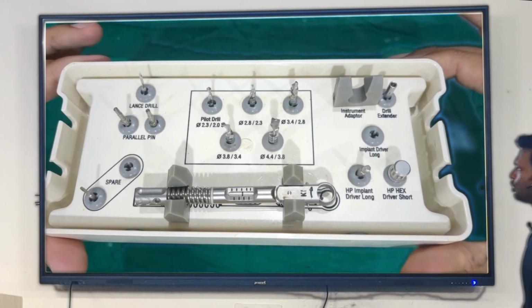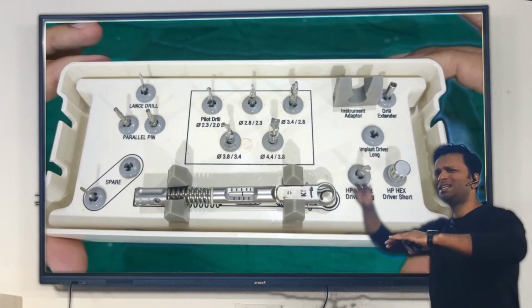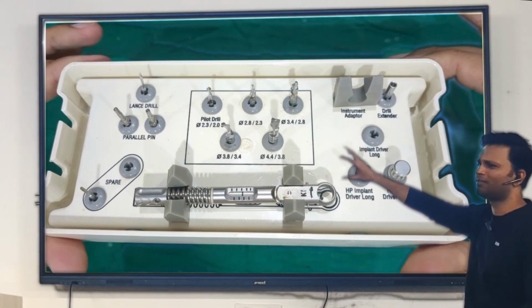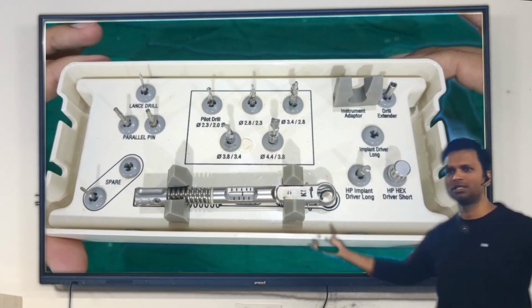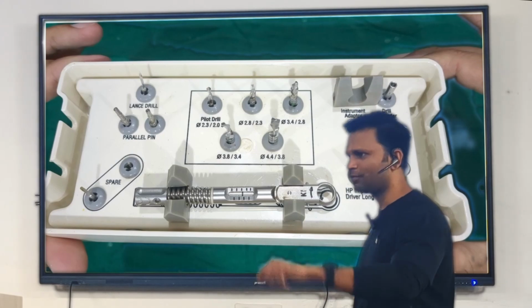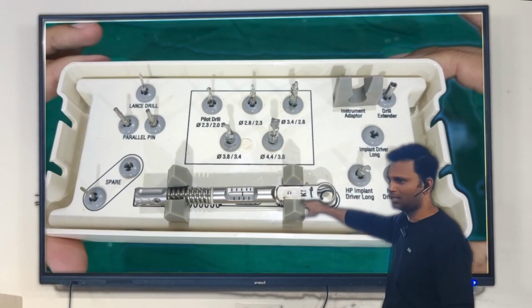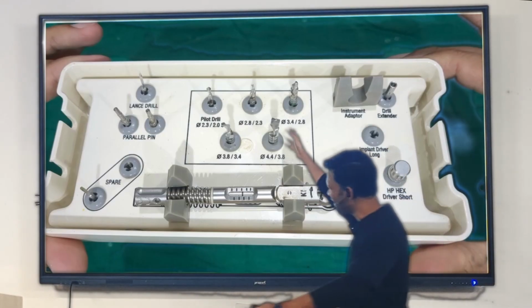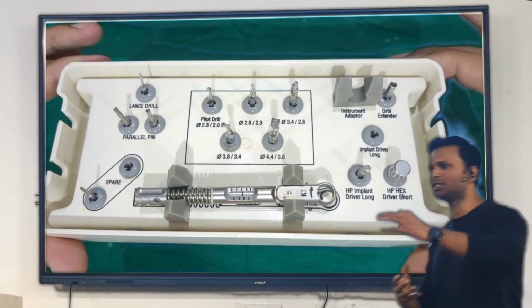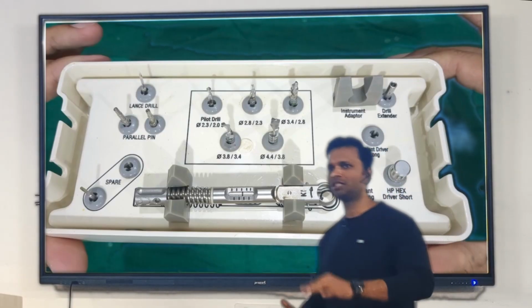I showed you all the instruments of the implant surgery kit. Now, there are many hundreds of dental implant systems in the world, and every implant system is going to have a somewhat similar kit. Some will have more instruments, some fewer, but the underlying principle is the same: we mark the bone, then we drill the bone, then we place the implant. Every kit is going to have a torque ratchet, drills, and a parallel pin. The shape or dimensions of those drills and parallel pins might be different in different kits, but the underlying principle is always the same.